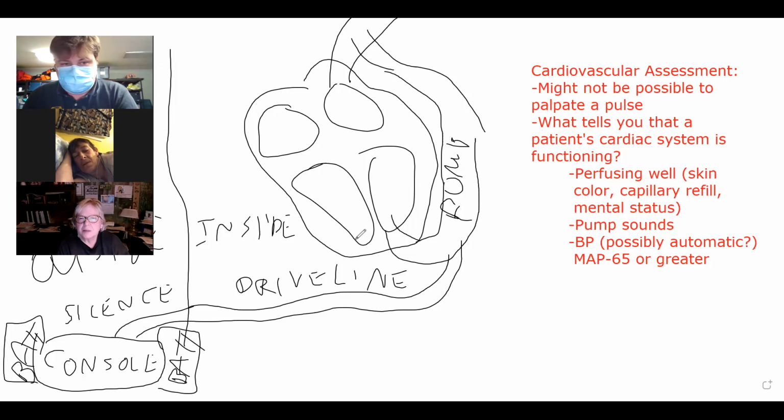So if the unit's alarming, when we arrive they're unresponsive, and it's an unattended, unresponsive patient with the alarming. How long, if it's a problem with the batteries and you get the batteries and the unit going again, and they're still unresponsive, what's the timeline on this? I mean, it's like an unattended cardiac arrest, right?